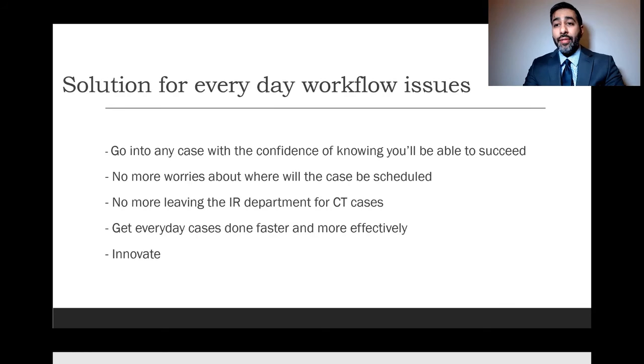Or having the confidence going into a simple case like a lung biopsy, develop a tension pneumothorax, boom, switch right over to fluoro, get my chest tube in without any complication. Or if you had a hemothorax that would develop, and switching right over to fluoro and getting that done without any hesitation. Ultimately, you don't have to worry about where your cases get scheduled.